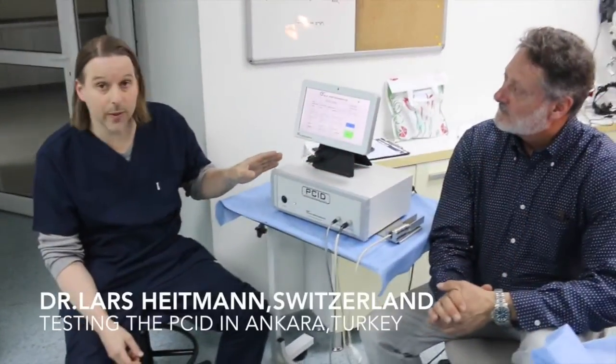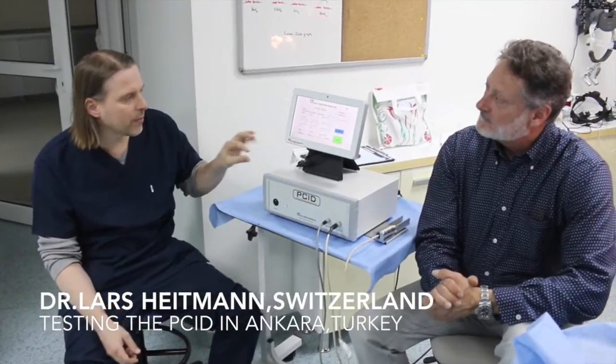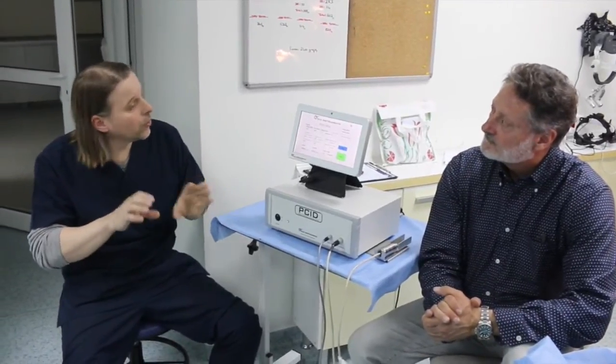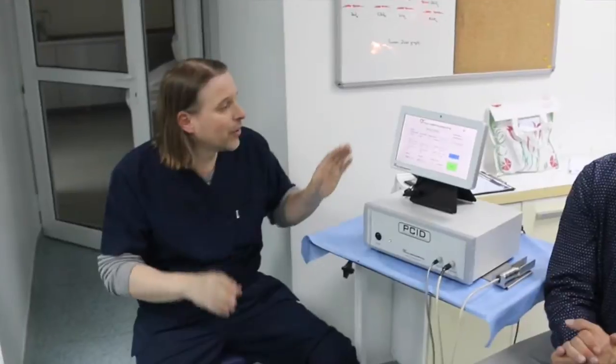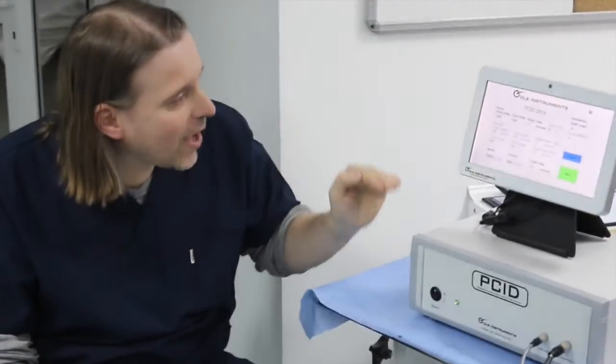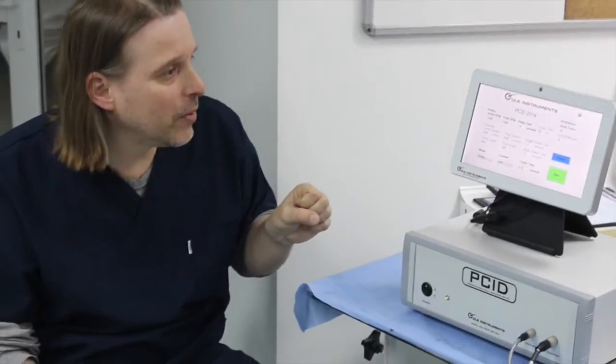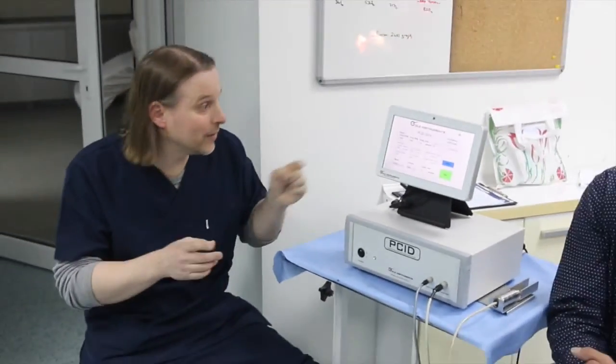What I like about the PCID is that you can program the settings and you can imitate manual oscillation. I tried many different motorized devices with only rotation or oscillation, but you can never program it down to so few oscillations per minute. The good thing is you can combine rotation and oscillation and program it the way you want.